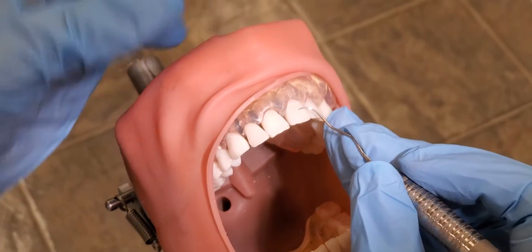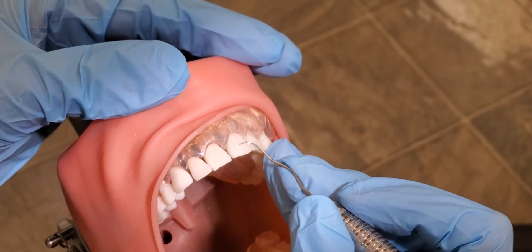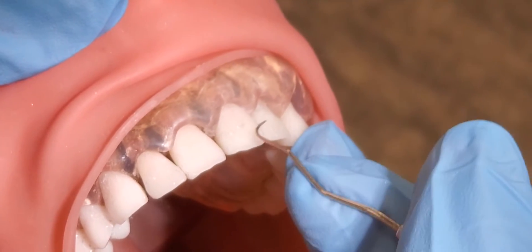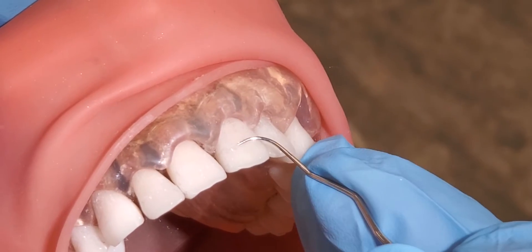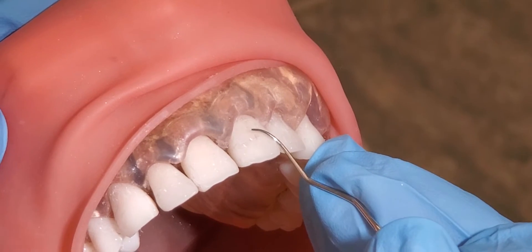When you're doing anterior teeth, you're going to divide the tooth down the middle, and I'm doing surfaces towards, so my tip is pointing towards that towards surface. I also need to make sure that my tip third of my instrument is on the tooth — the tip third instead of the middle third or the heel third.